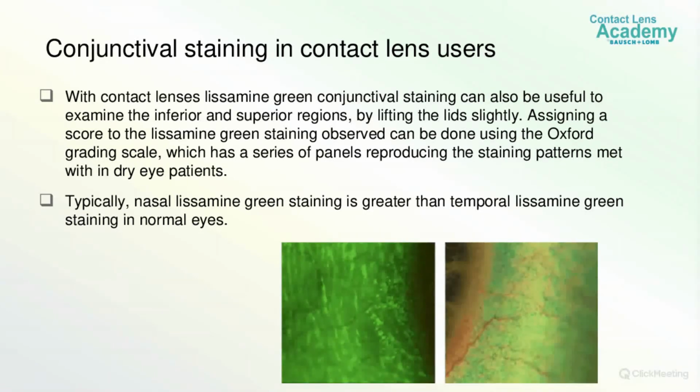Conjunctival staining in contact lens users. With contact lenses, lissamine green conjunctival staining can also be useful to examine the inferior and superior regions by lifting the lid slightly.